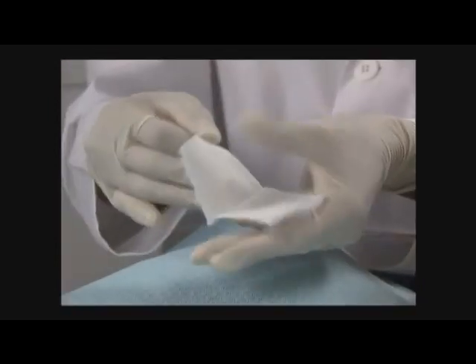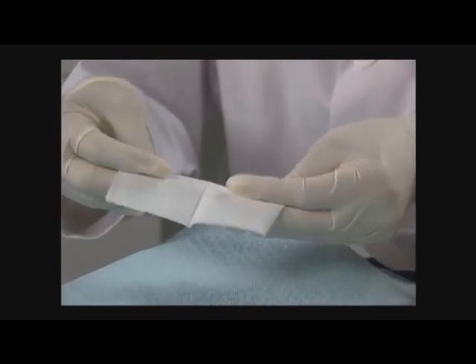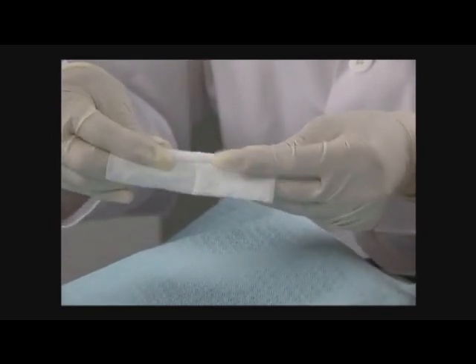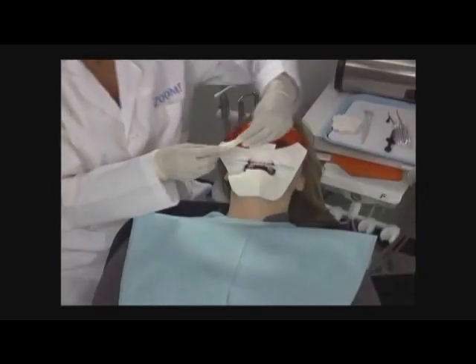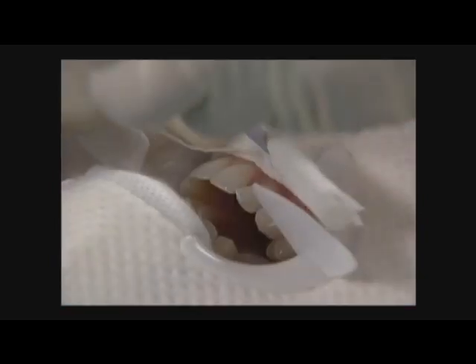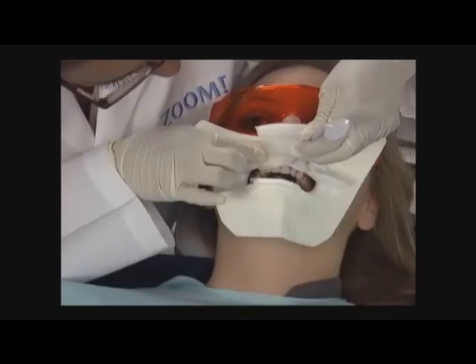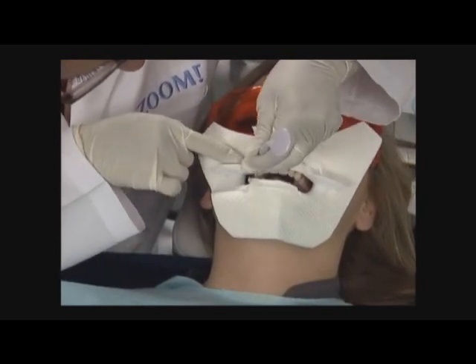Open the third 2x2 piece of gauze into a 2x4 piece. While holding the ends of the gauze, roll it lengthwise to resemble a cotton roll. Align the crease with the midline and place it in the upper vestibule. It should cover approximately first molar to first molar, number 3 to number 14.